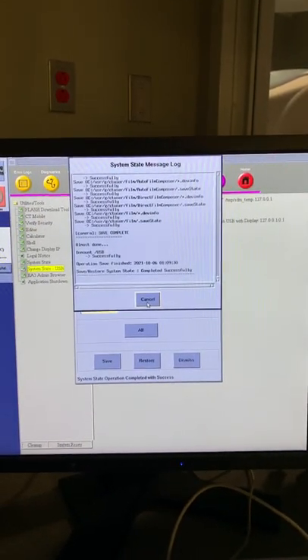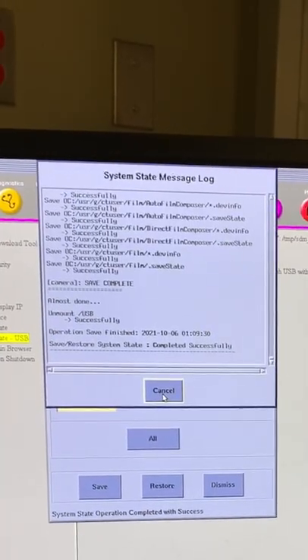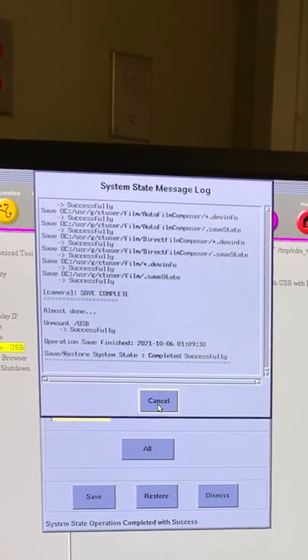At this point it is okay to click the cancel button and then dismiss to close the system state window out.